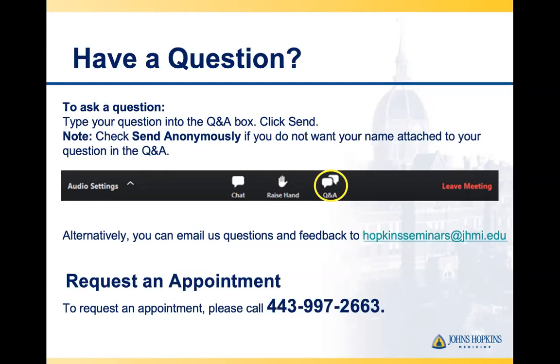Number 10, are there issues with cobalt joints for knee replacements? Great question there. So a lot of patients seem to be having allergies to metal, or at least hypersensitivity to metal. Knee replacements, typically the part that goes into the thigh bone is made out of cobalt chromium, and the part that sits in the leg bone is made out of titanium to absorb the forces a little bit better and make it more friendly.